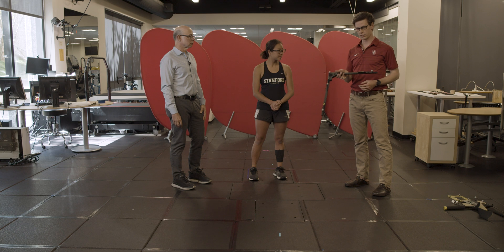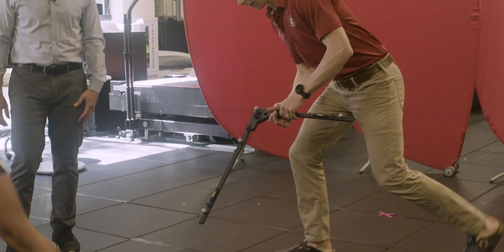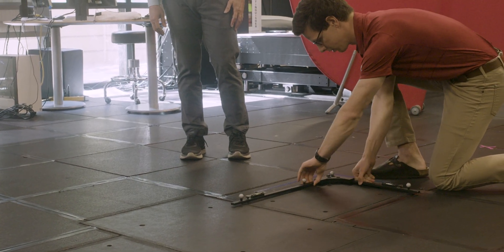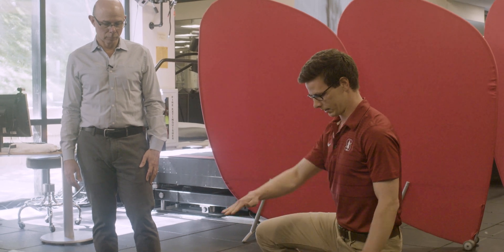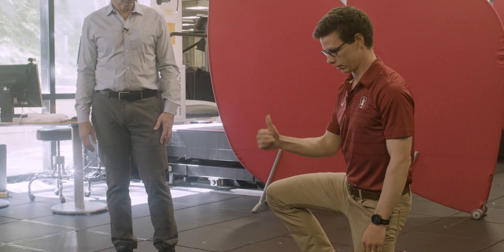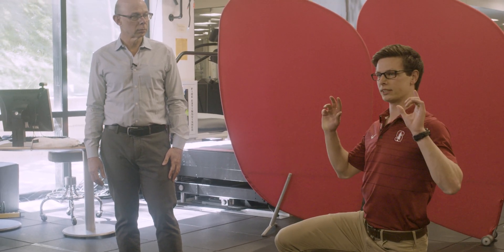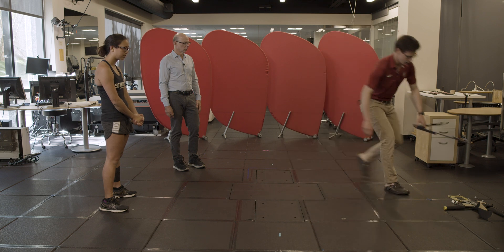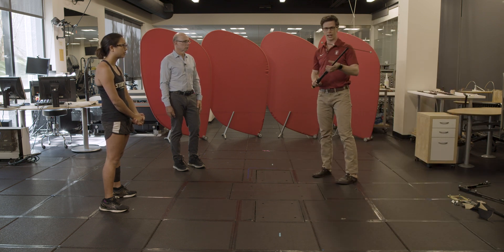The first step is using a rigid calibration frame like this. We put it down to establish our lab origin — here it's the corner of one of our force plates. We have four markers so we can establish the ground frame, and then the vertical direction is orthogonal to this. We capture a single frame of this.